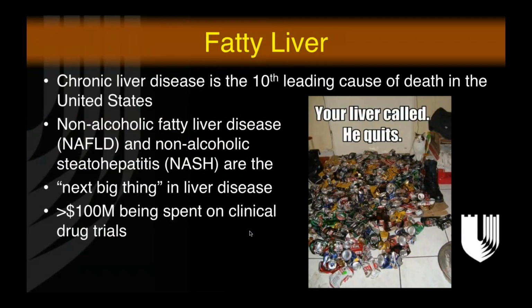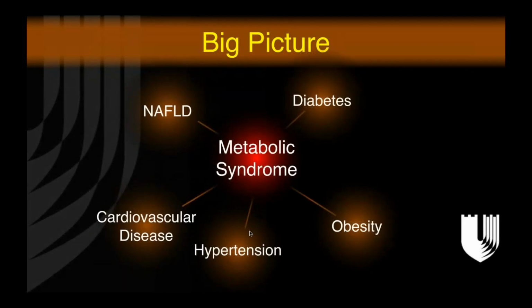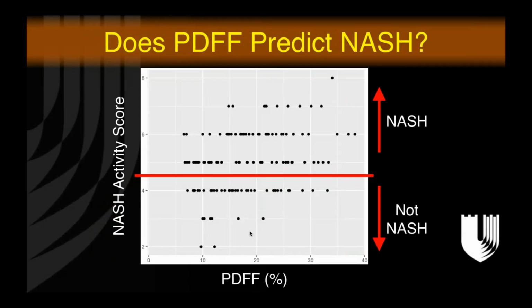So now switching to liver fat quantification. Here the story is a little bit more muddy. We have this motivation that liver fat is a major cause of morbidity and is becoming the main cause of chronic liver disease, and that it's part of the metabolic syndrome, which is becoming more common and more severe in patients in general. But the story with liver fat is not as clear-cut as it is with liver iron.